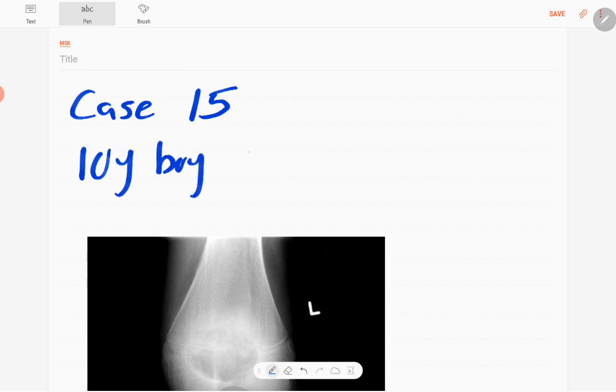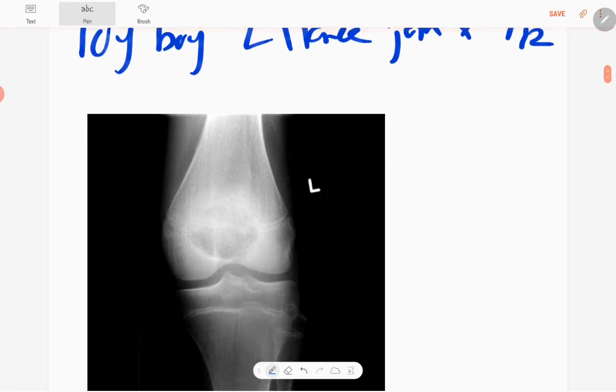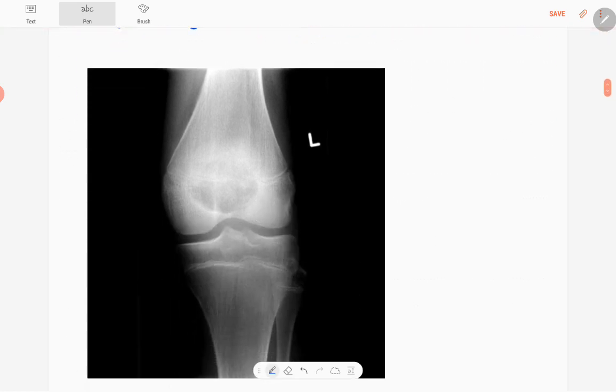So this is the anteroposterior radiograph of the left knee joint in a skeletally immature patient.